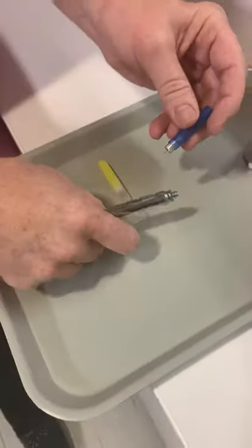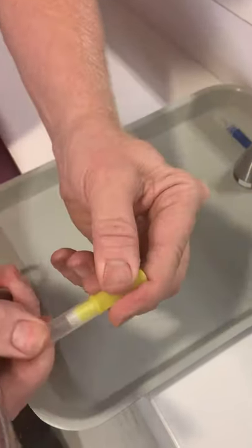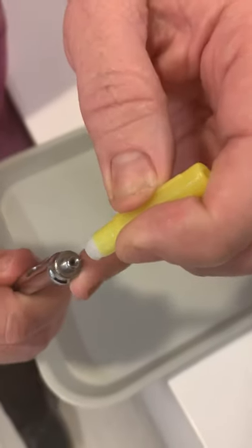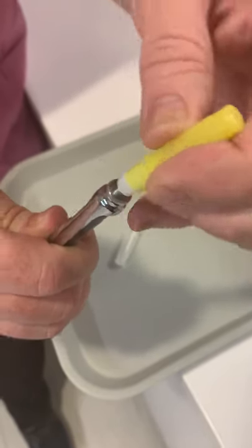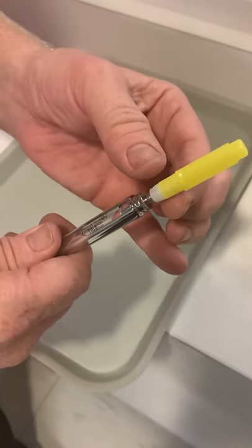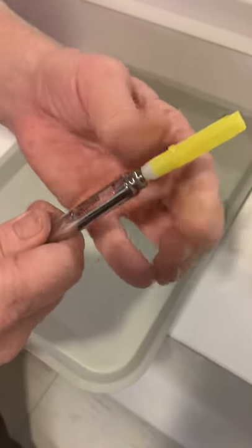Pull the cap off, have a fulcrum, and the needle is just going to go right into that hole. Then you're going to tighten it down on there. Make sure that when you twist, you're twisting between the hub and the cap.